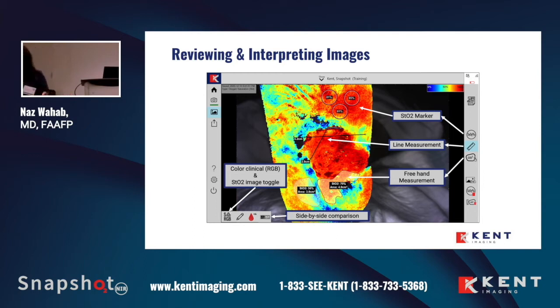Those of you that are doing reconstruction or pre-intervention, I think it's very important that you can also freehand measure certain areas. So for example, if you're doing surgical management, you do need to do some mapping. You need to understand my flap. Does my flap even have where I'm potentially going? Does it have enough oxygenation for that to survive? And I think that these images are very important once you start utilizing them in your practice, that not only can you use it preoperatively for planning, but postoperatively to ensure that your surgical outcome is really truly what you're looking for.